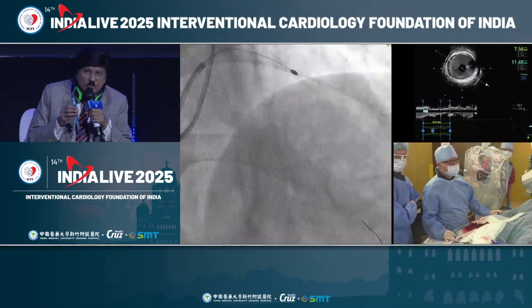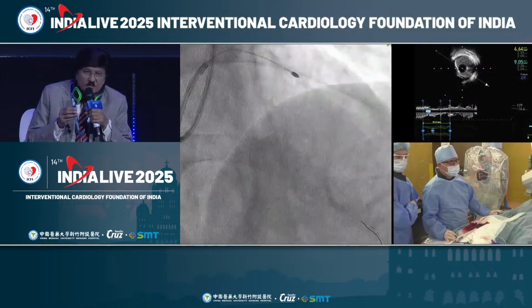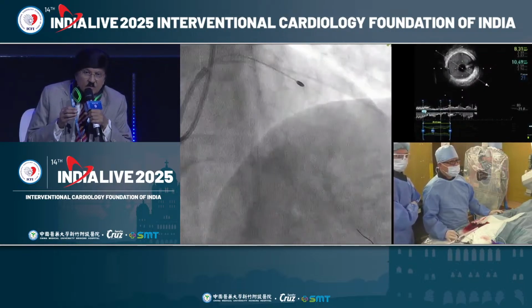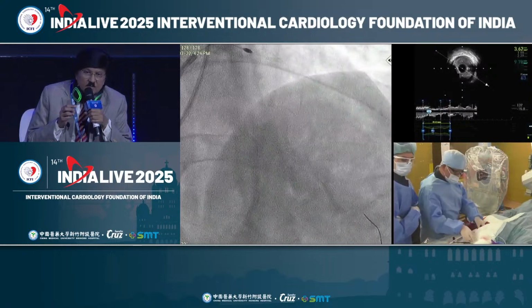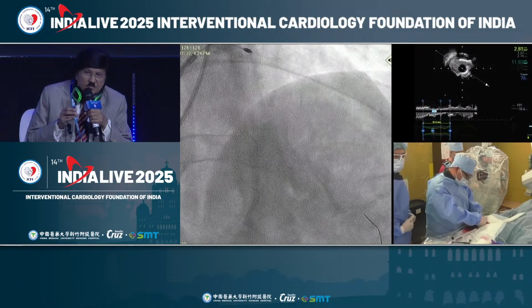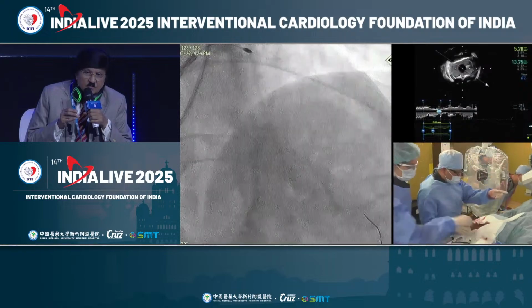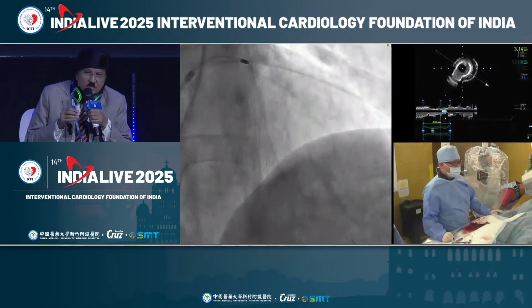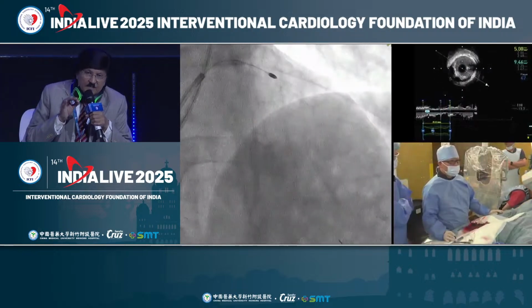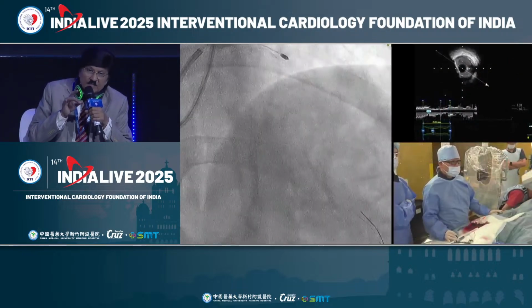Looking at the wire bias, the location of the IVUS catheter can help show the wire bias, so please take a look at the IVUS catheter location. The wire bias is very good, because the IVUS catheter attaches to the calcium. Do you think there is a suggestion of a nodule over there?